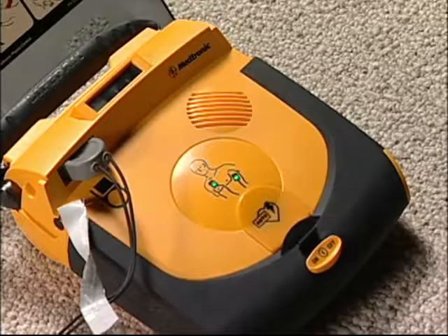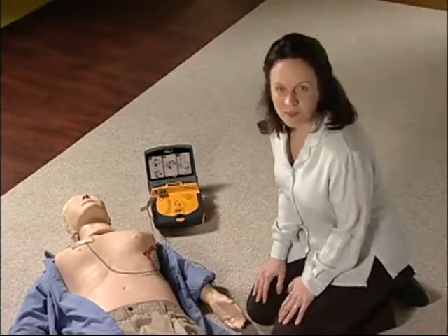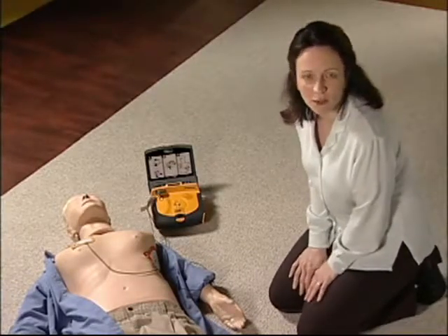Do not touch patient. Evaluating heart rhythm. It evaluates the heart rhythm within 11 seconds. Stay clear until it finishes. If you touch the patient or the AED now, you might interfere with the evaluation.